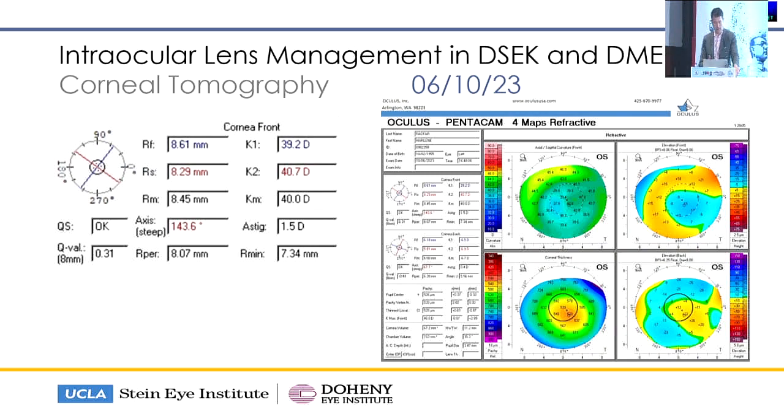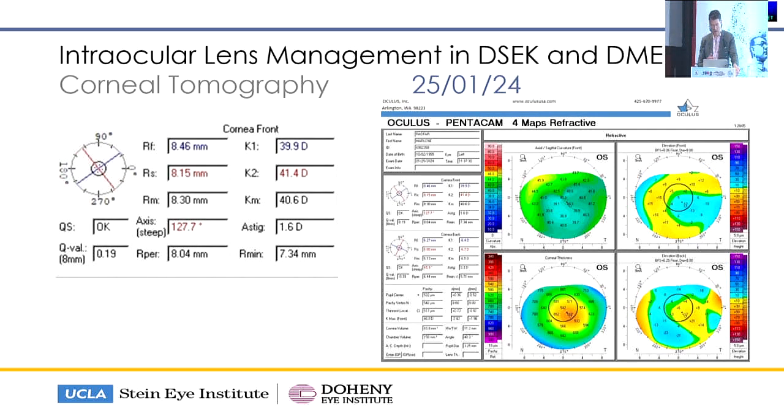They were done correctly. Well, here's the patient's left eye. This is in October, so we are here about 5 months post-op. You can see that that mean K value is 40.0. Remember, pre-op, it was 43.6. The other eye was 44. So this eye is 4 diopters flatter than the contralateral eye. I said, well, it's going to hopefully steepen over time. It did a tiny bit, but only to 40.6.